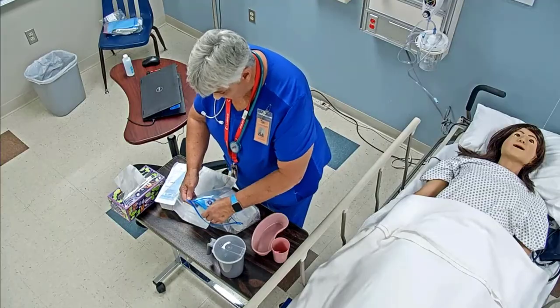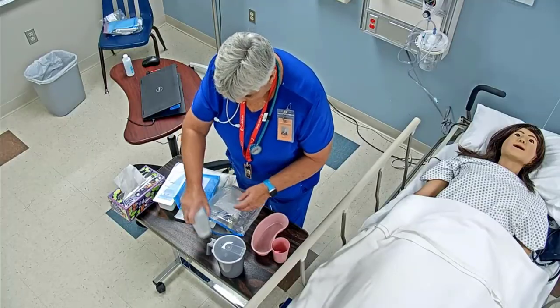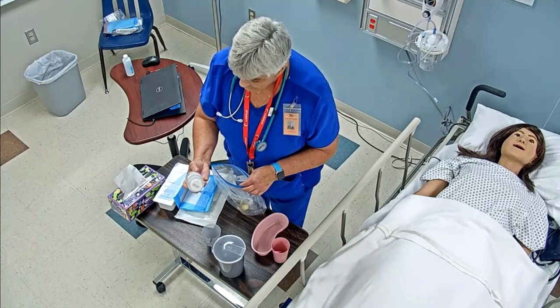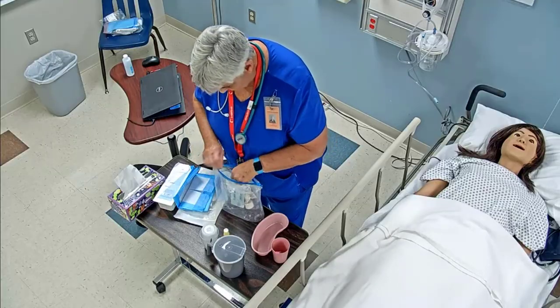I'm just checking to make sure that the package is intact and that it is still sterile. And then I will need a blue pad, so I've got my blue pad. I'm going to need either normal saline or sterile water. In this case, I've got my sterile water. I'm checking my expiration date, and it says sterile water on there. I'm also going to be needing lubricant.